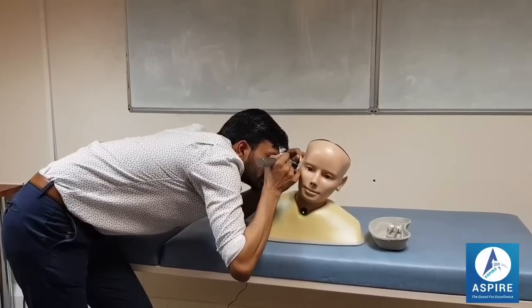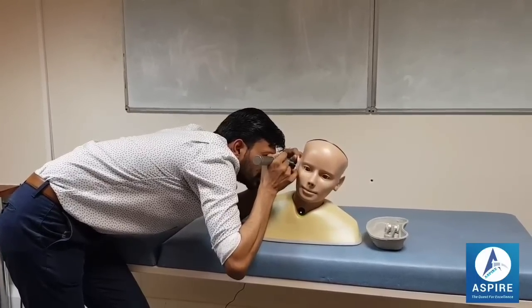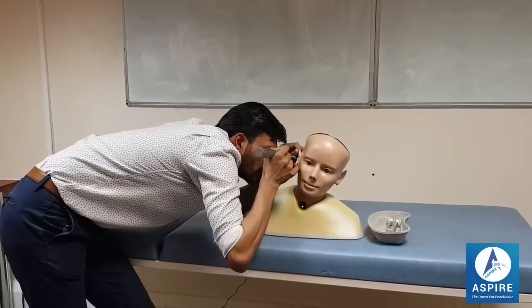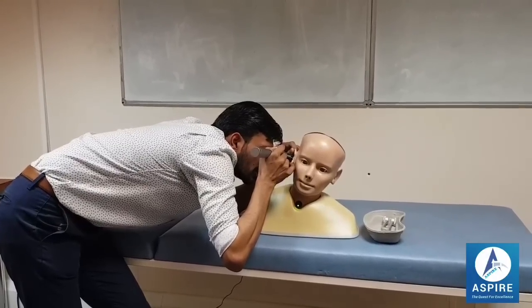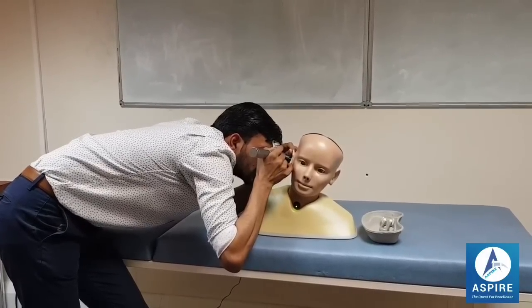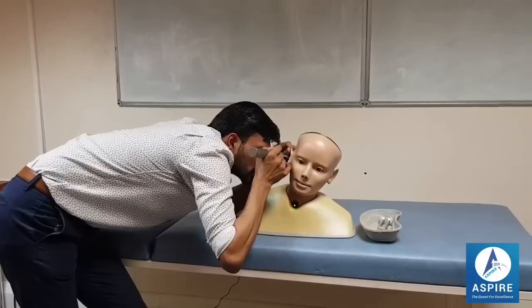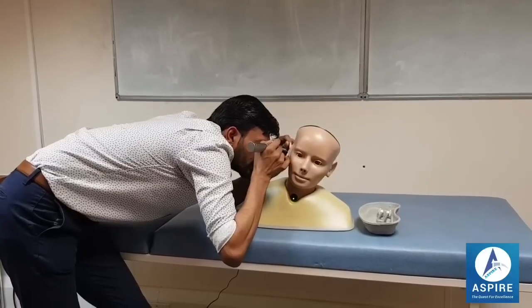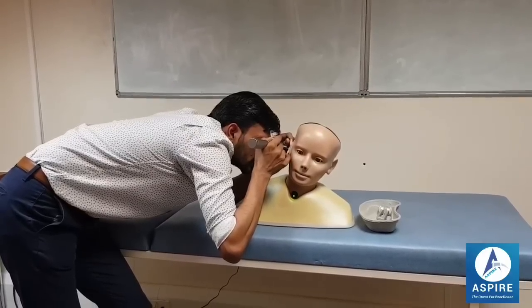I can see the tympanic membrane — it is red, congested, inflamed, edematous. I cannot see the cone of light, umbo, or light reflex. Pars tensa and pars flaccida are not visible. My most probable diagnosis is otitis media. Now I'm going to take out this instrument.